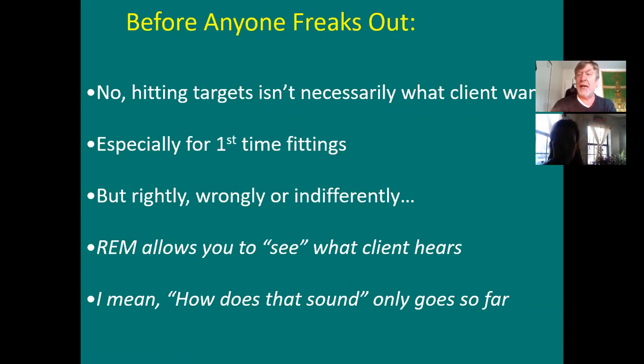So you may want to not necessarily, that's why I say before anyone freaks out, don't have a freak out, just take a pill, I'm going to say. The nice thing about Real Ear is you can deliberately underfit, and you can write in the file, I did this on purpose, and later on, this is what I'm going to do.